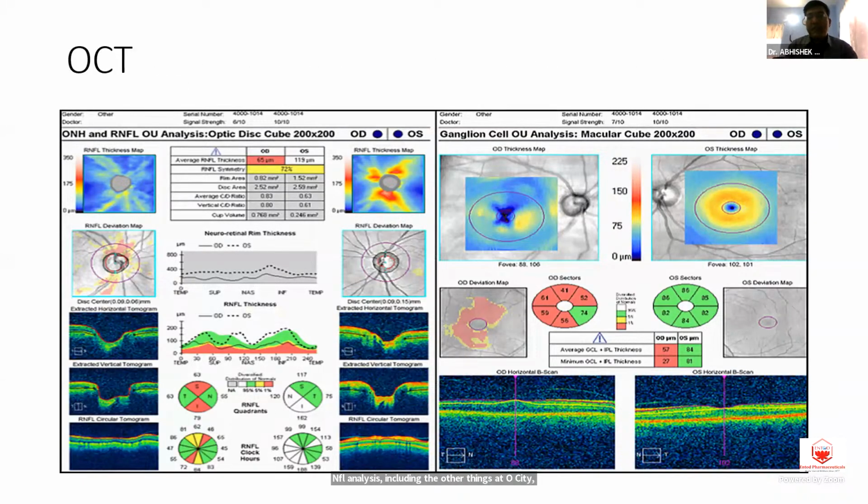Yes. So I will be talking about this slide regarding what you should be looking for when analyzing the RNFL. Mainly you need to center your scan around the disc. Actually, the machine does it for you. It's around 3.4 to roughly 3.5 millimeter in diameter, encircling the disc, because the RNFL is thickest around the disc, so the analysis is more prominent here. It comes with a color coding depending upon how many standard deviations it falls outside the normal. So you get red, yellow, or green, that is, outside 1%, outside 5%, or within normal limits respectively.